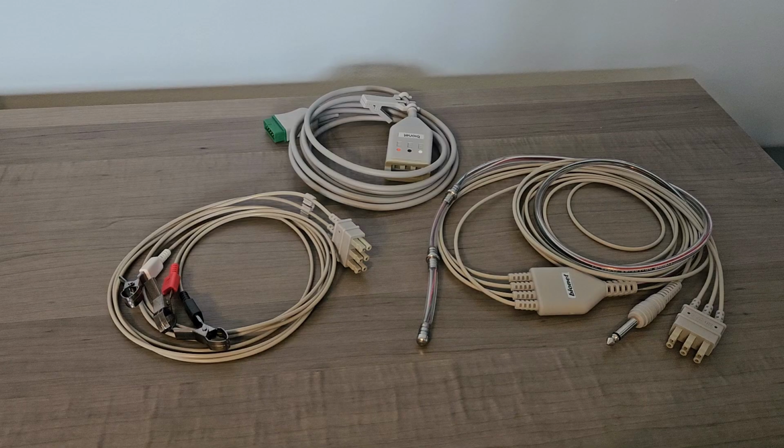By default, your monitor will measure the respiration rate via the 3-lead ECG clips. When using the esophageal probe, respiration will have to be obtained using an EtCO2 sensor. To use the esophageal probe, measure it against the patient to ensure it does not reach past the sternum.